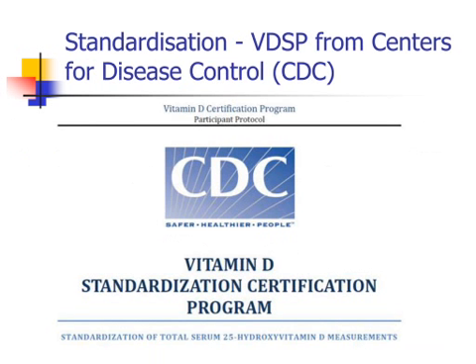The one thing we haven't got to yet, and this is sort of on the future work list, is the CDC program. Because of so many of the vitamin D studies out there, there's been some questions raised about how good the data is based on the method they use to measure it.